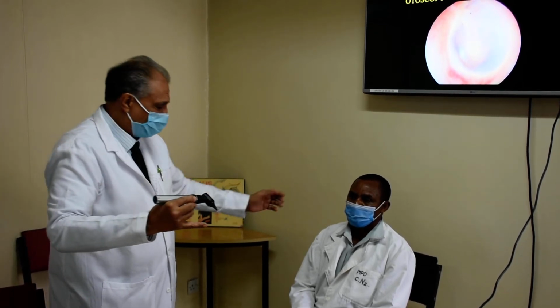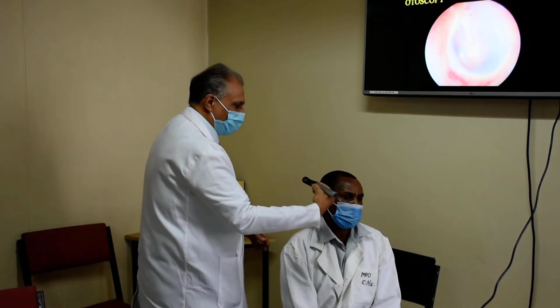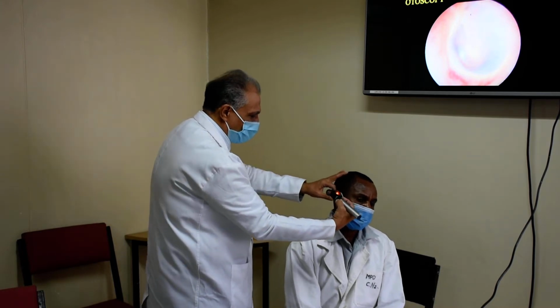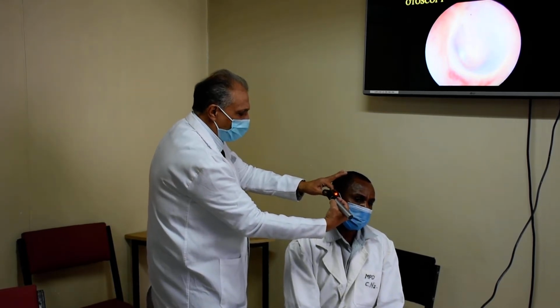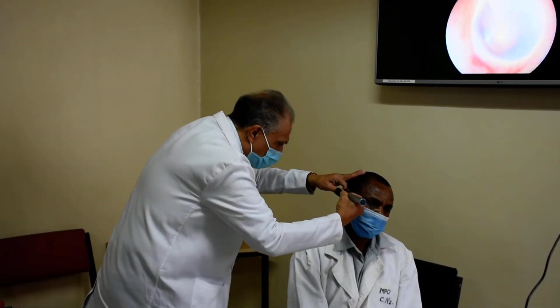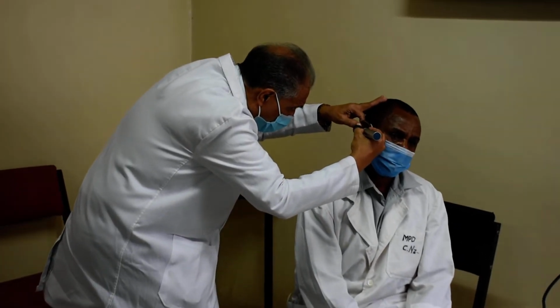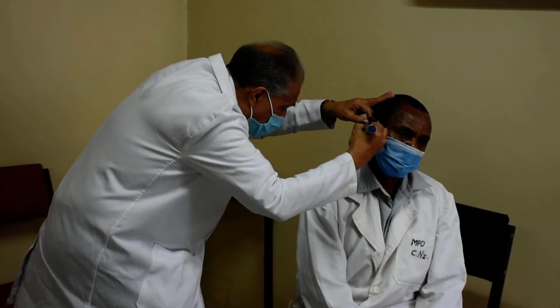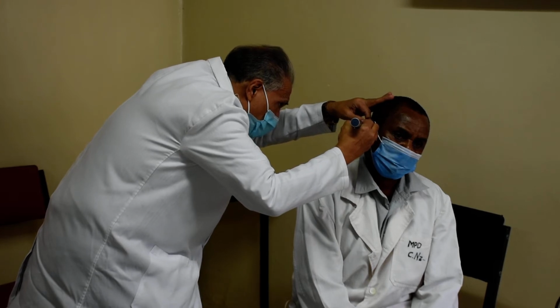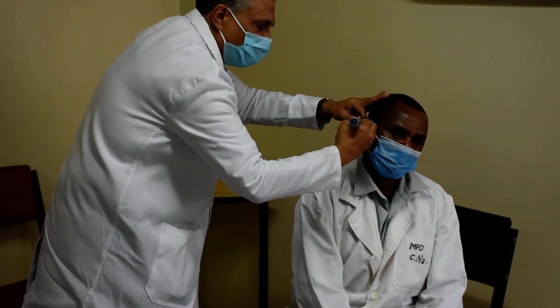So when you're examining the right ear, you have to hold it in your right hand. The first thing you do is place the little finger on the cheek, so it becomes your fulcrum, and then the pinna is pulled gently upwards, outwards, and backwards to straighten the canal. Then under vision you advance the speculum and look at the external auditory canal and the tympanic membrane, both of which are usually very clearly visible. The patient should have no pain and there should be no tension at all. That is the correct examining position.